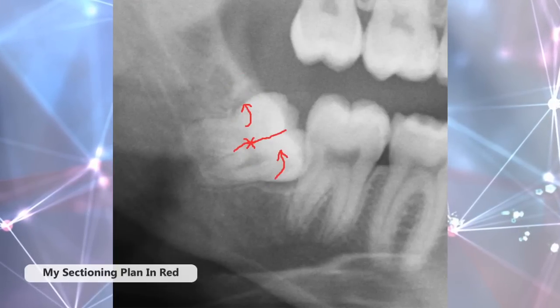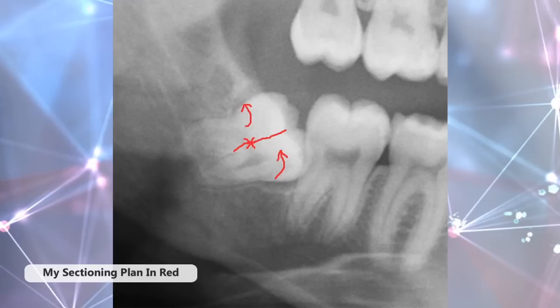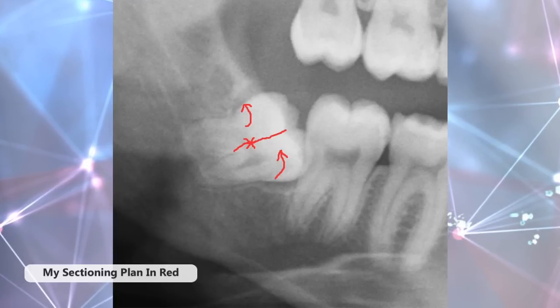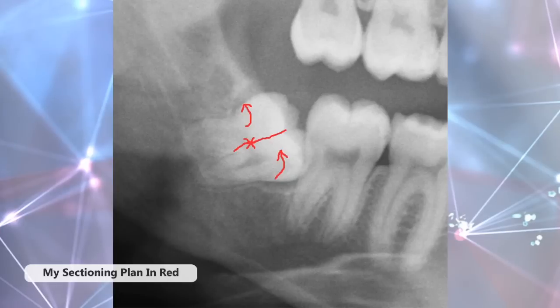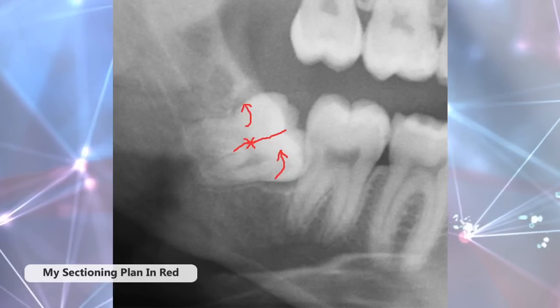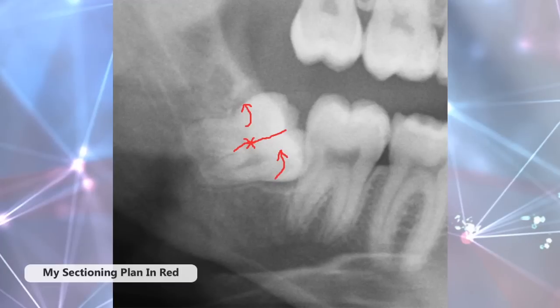We'll first elevate the distal root and then the mesial root after the distal root is out. By following this sequence, we avoid any pressure on the IDN when we elevate the mesial root. The star marks where I start my section — I expose the pulp chamber first and use it as a guide to go apically and coronally.